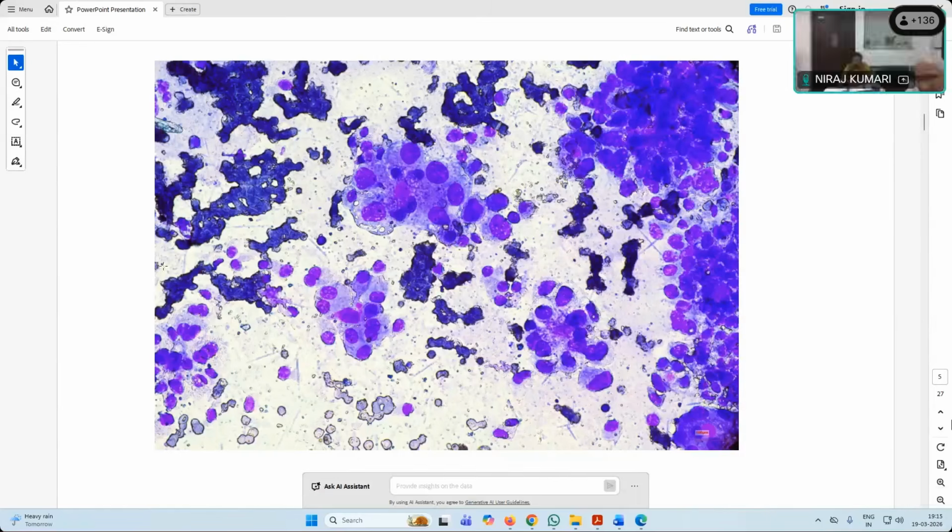So in this case, the basic message is that whenever you get an FNA from a cervical lymph node with the papillary kind of structure or papilloid structures, you have to think of the possible primaries. Okay, and then you have to see, based on the morphology, how will you exclude one by one? Somebody said medullary, from thyroid. Thyroid medullary can sometimes have a papillary pattern, but then again you have to pay attention to the nuclear character.